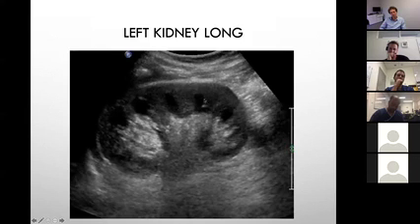We got almost anechoic pyramids in there, and you got echogenic sinus or the collecting system and fibrofatty tissues. You can see some streaky, linear, connecting anechoic structures, most likely the collecting system. Sometimes it could be blood vessels. So you probably need to depend on color Doppler to ascertain which is which.